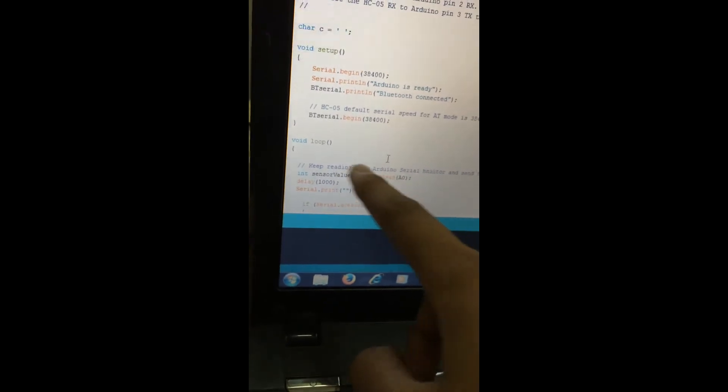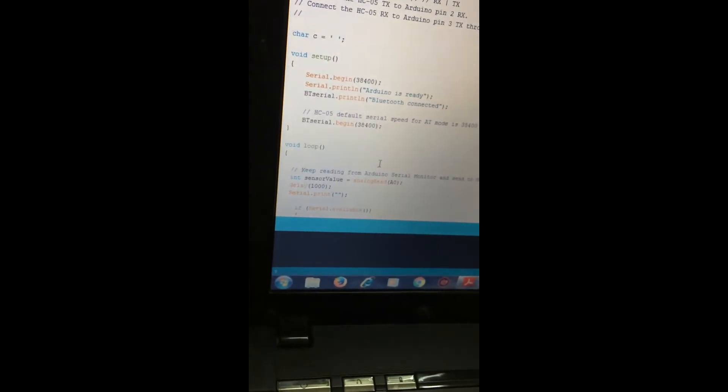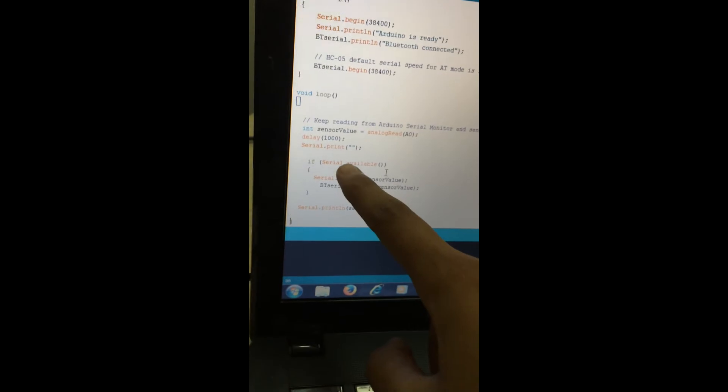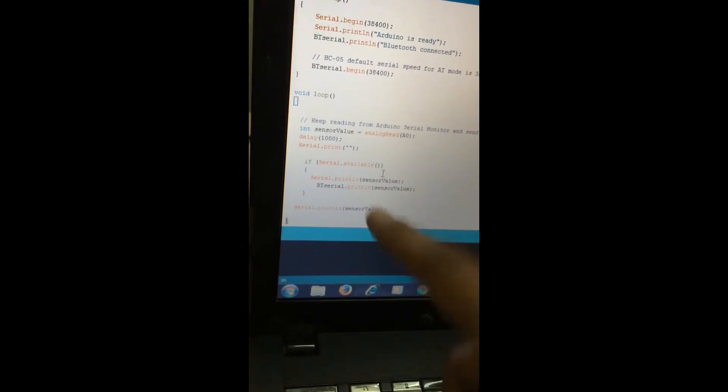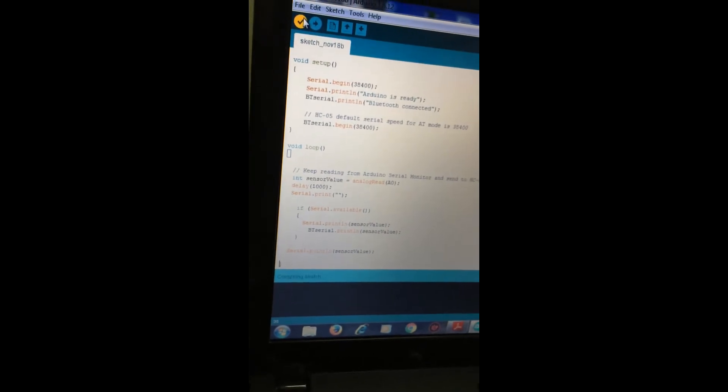The ECG sensor value is stored in the analog pin in a variable called sensor value. Whenever a value is present, if serial is available, then the sensor value is transferred to the Bluetooth. This is our code. Now we will first verify the code.